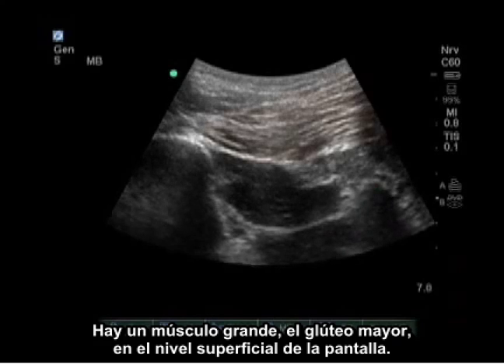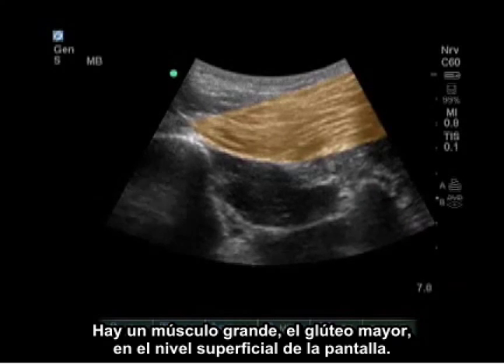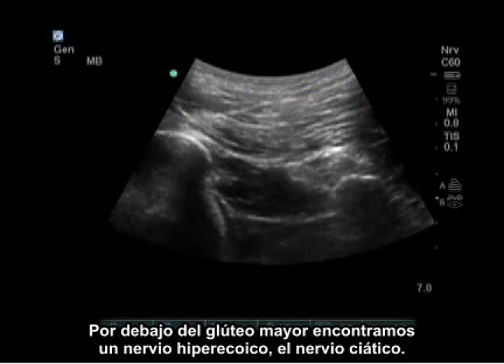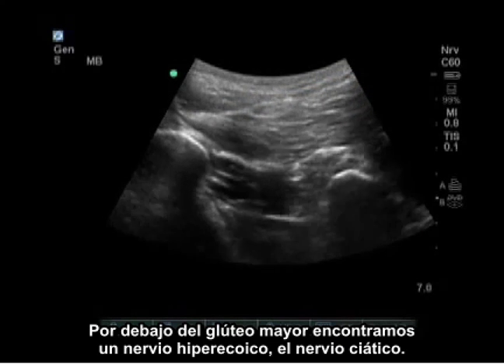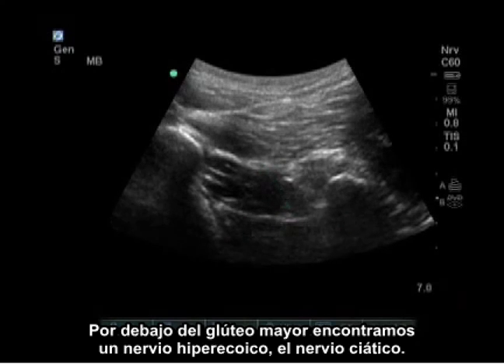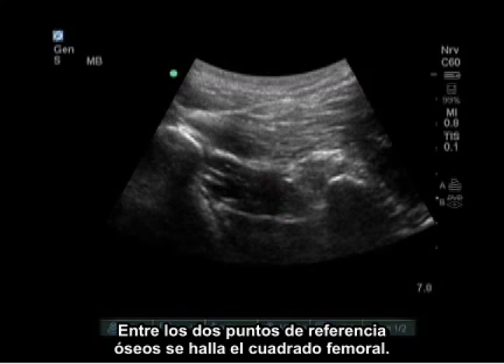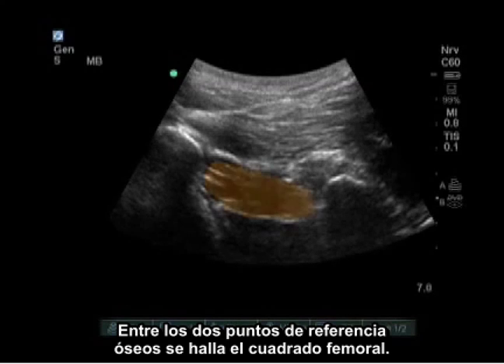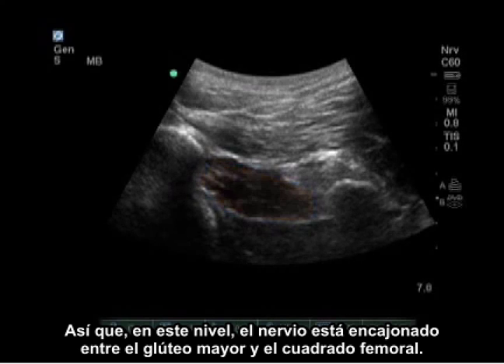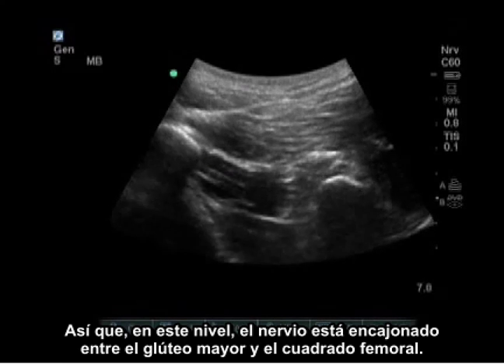There is a large muscle, the gluteus maximus, at the superficial level of the screen. Underneath the gluteus maximus is a hyperechoic nerve — the sciatic nerve. Between the two bony landmarks is the quadratus femoris. At this level, the nerve is sandwiched between the gluteus maximus and the quadratus femoris.